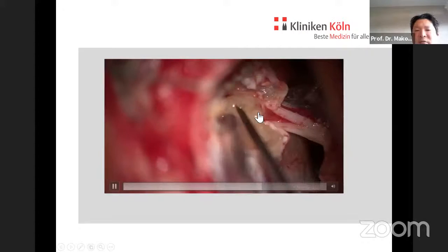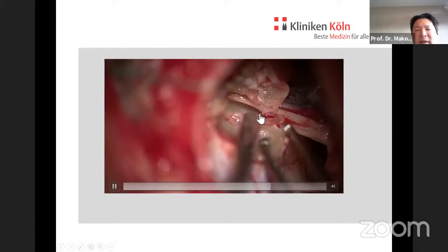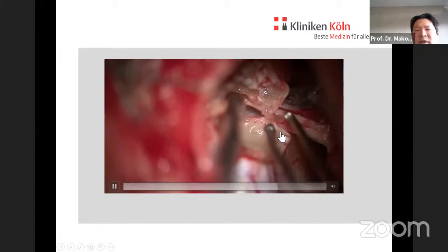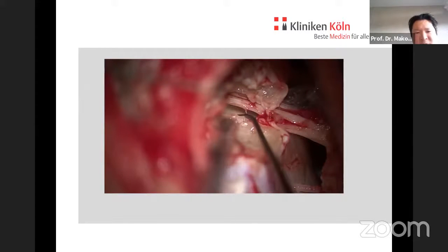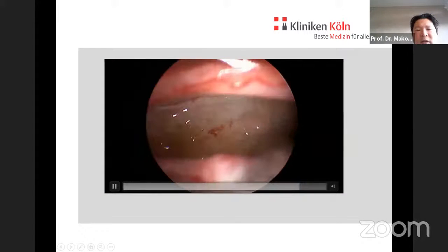This is the tumor, which is now removed from intracanalicular. And so all nerves are preserved here. All small parts are removed. And as you know, it's difficult to look into the fundus with a microscope. So when you use the endoscope, you can finally check whether everything is removed.